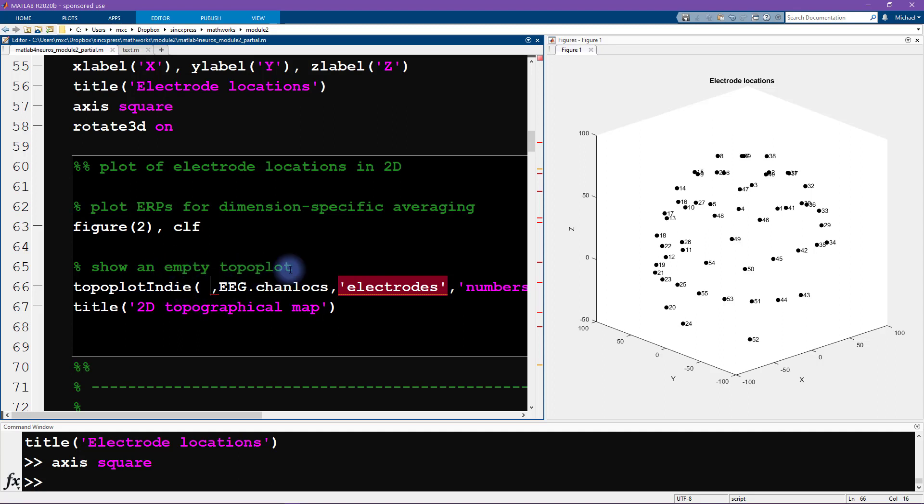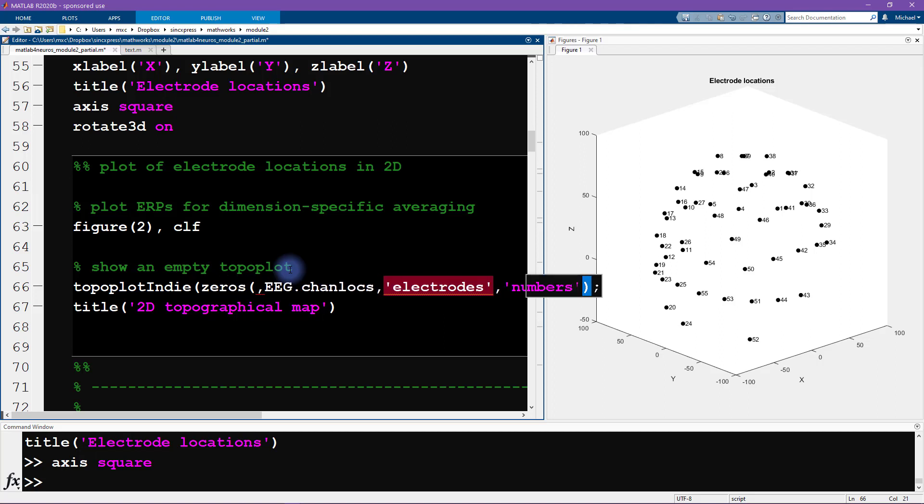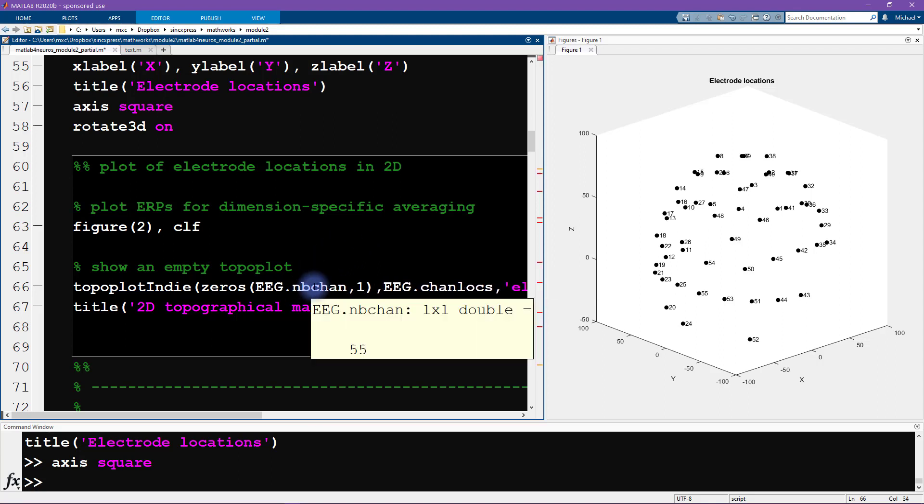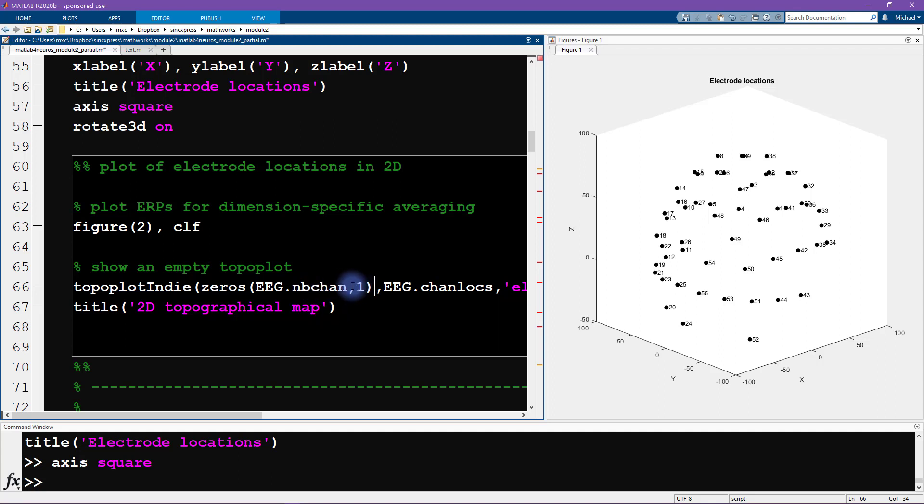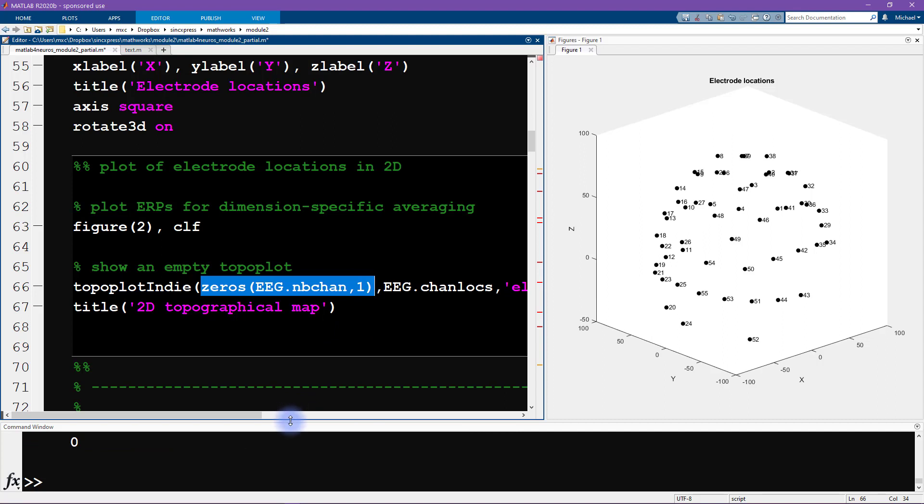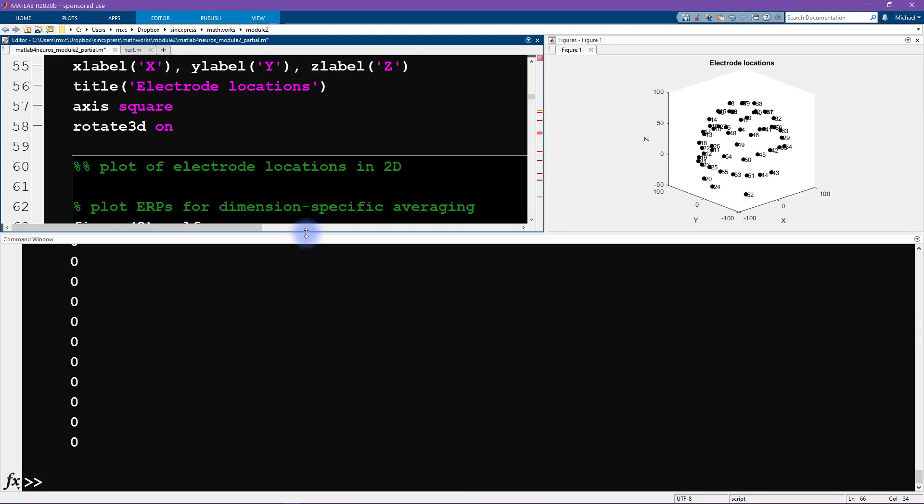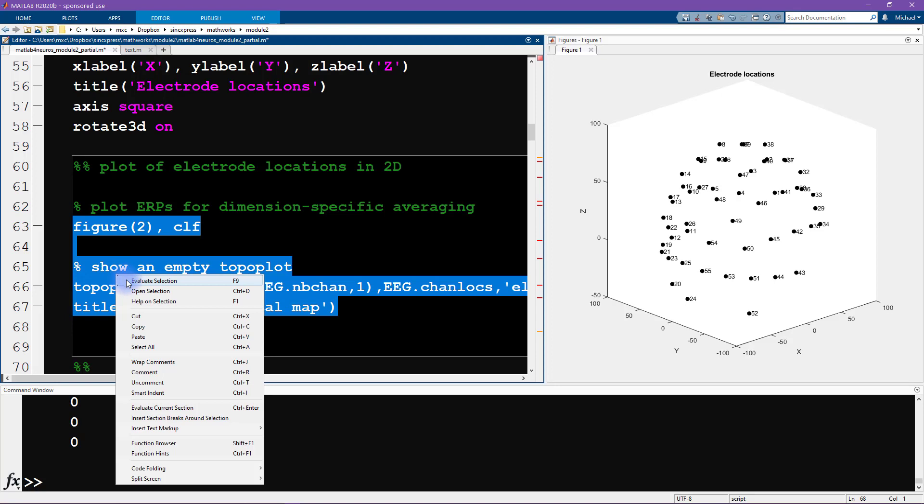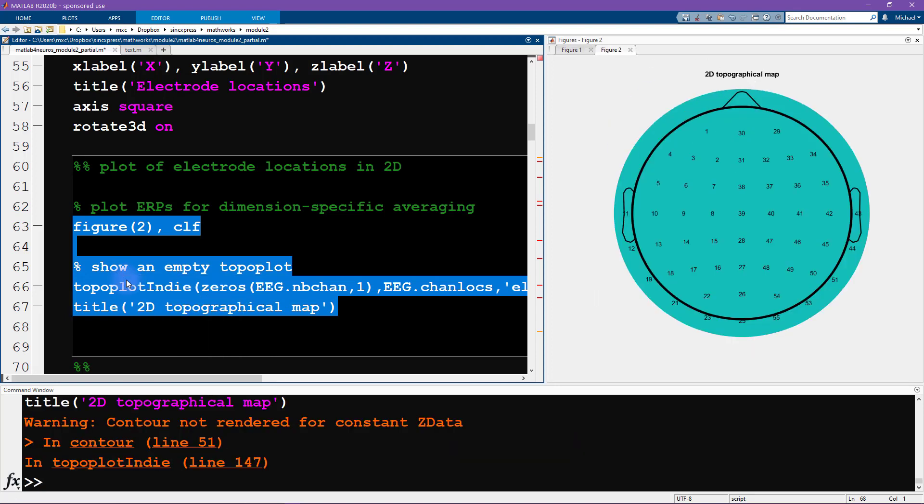For right now, I'm just going to input all zeros. So I'm going to create a matrix of zeros. We want to have nbchan by one. nbchan is one of the fields in this EEG structure, it just tells us the number of channels we have in the data set. And the comma one here is to produce a vector. So this is a column vector of zeros, where the number of zeros corresponds to all the electrodes. Just some empty temporary data that we can show. And that looks like this. Now we see our two dimensional topographical map, just like what I showed in the slides.